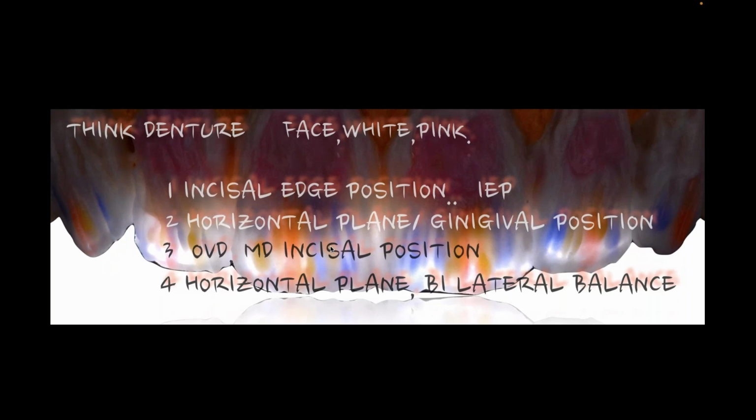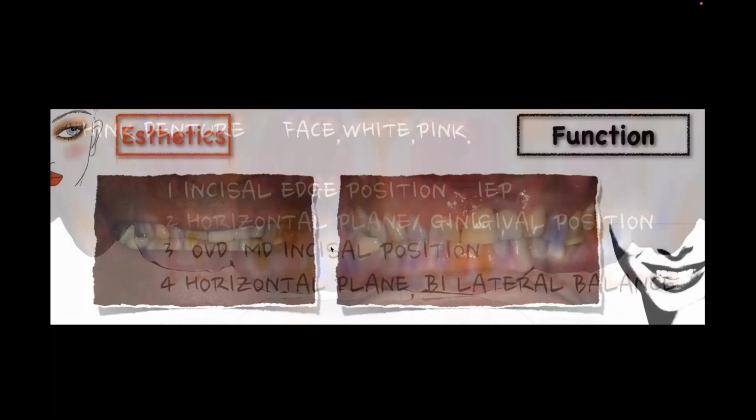I want that bilateral balance. I want that simultaneous contact. And I want to make sure that I'm not affecting the envelope as I'm closing my arches. So it's kind of the same for me over and over again.